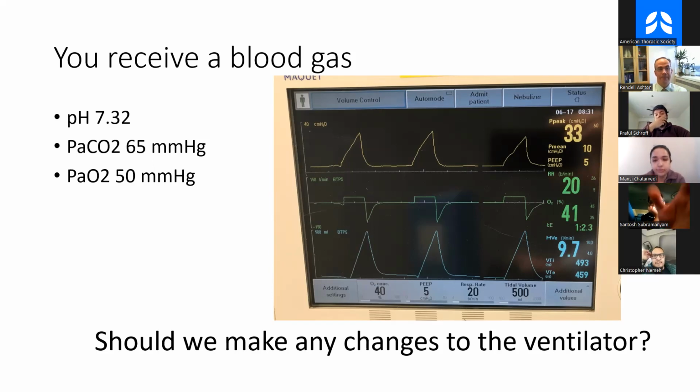So I think looking at the peak airway pressure sitting at about 33, which is already a little bit on the higher side for volume control mode. And you know that you're already dealing with what I'm assuming 500 for this person is likely particularly lung protective. And so ideally for ours in our protocol, you'd want to go up on the PEEP, but you probably want to make sure your driving pressure isn't changing too much. Otherwise, you could just make an adjustment to the FiO2 and see if that shifts things in a more favorable direction. All right, great answer.